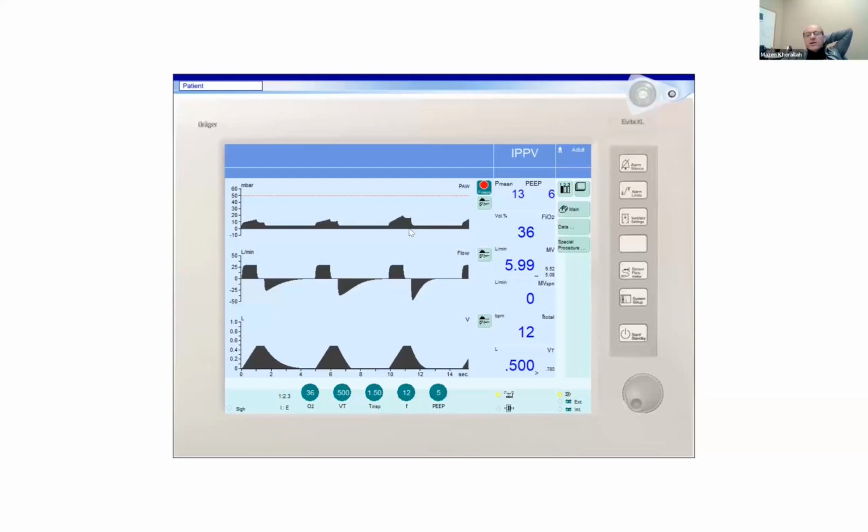Okay. You need to take into account the true driving pressure. Again, the true driving pressure is what the patient is generating at the same time, combined with the pressure from the ventilator. So that would be the plateau pressure minus the intrathoracic pressure, which you cannot measure unless you have an esophageal catheter placed in the patient.